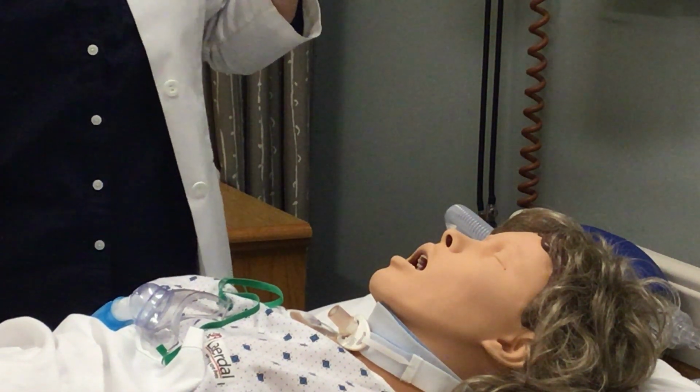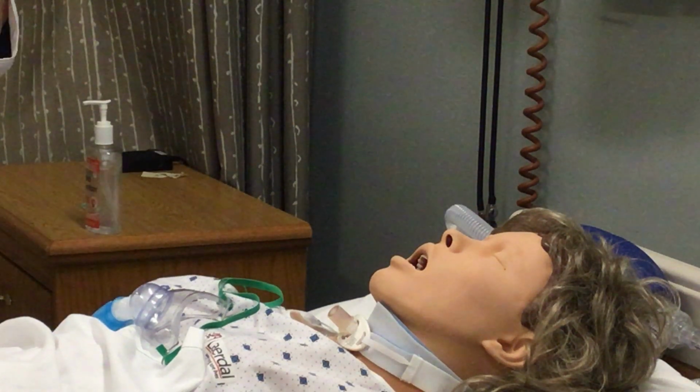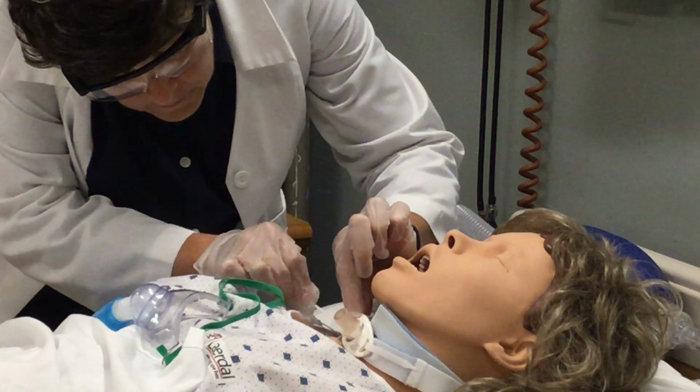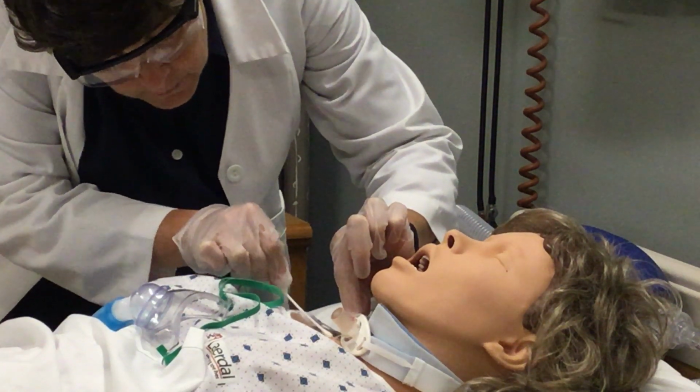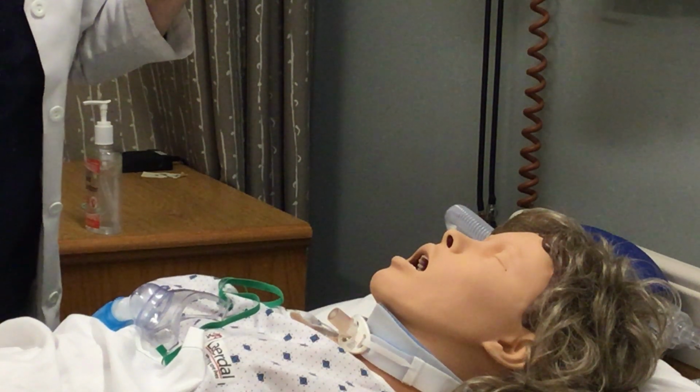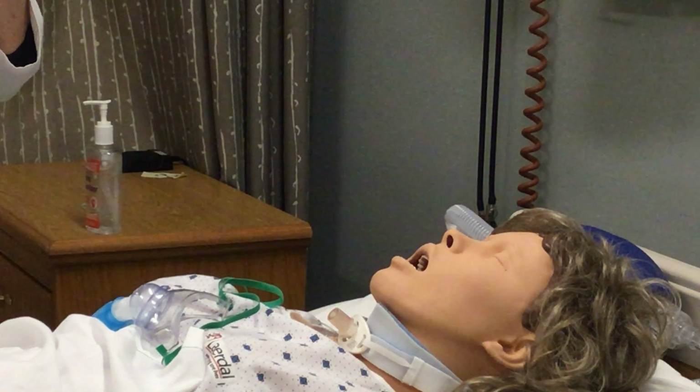This is dirty, so I'm going to throw that away. And I'm going to clean this side. Basically what you want to do is get rid of any secretions or crust. Sometimes 3 Q-tips is not sufficient, so you may need to bring extra.